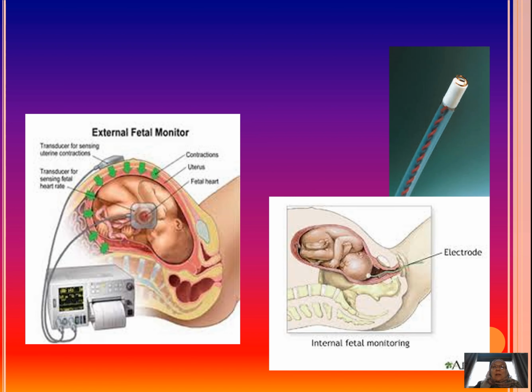With a little screw, it allows you to monitor the fetal heartbeat directly from the fetal scalp, giving a picture without loss due to movements or loss of contact of the CTG probe with the fetal heartbeat. So this is just to make you see that this is possible.